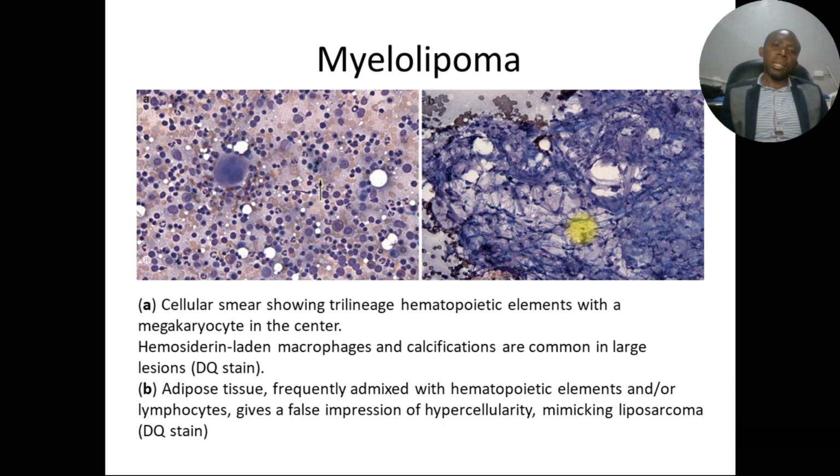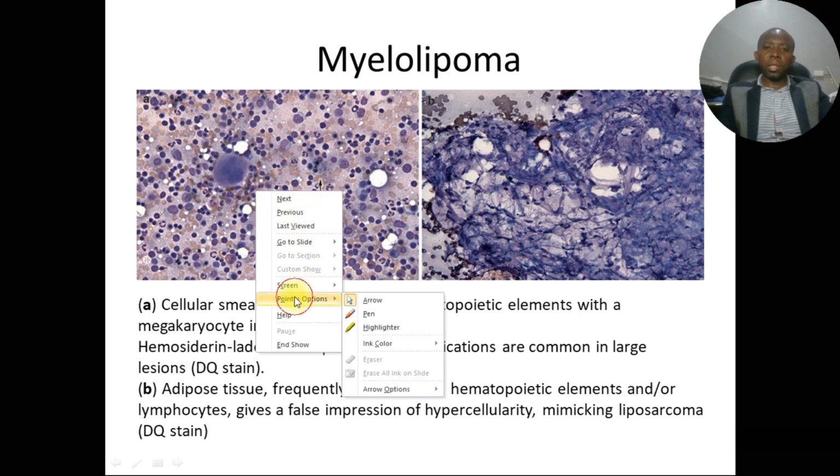So looking at images of how the myelolipoma will appear on the slide, on our left we have, let me get my pointer once again.